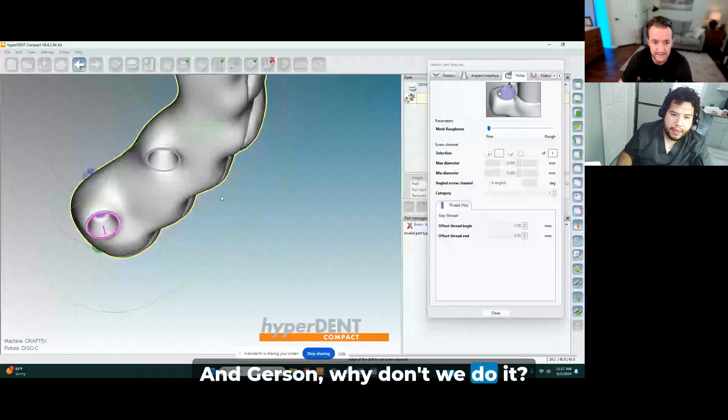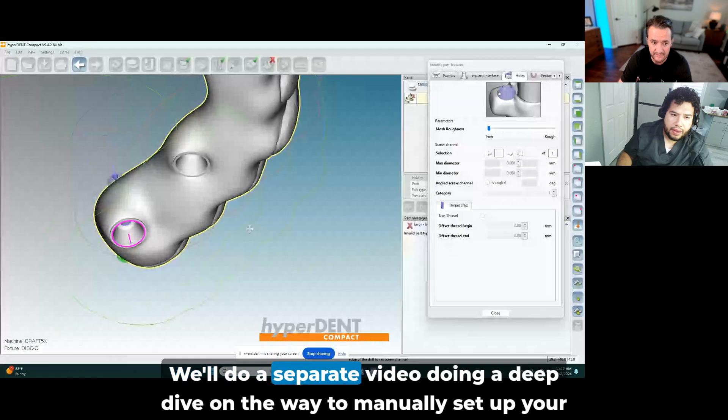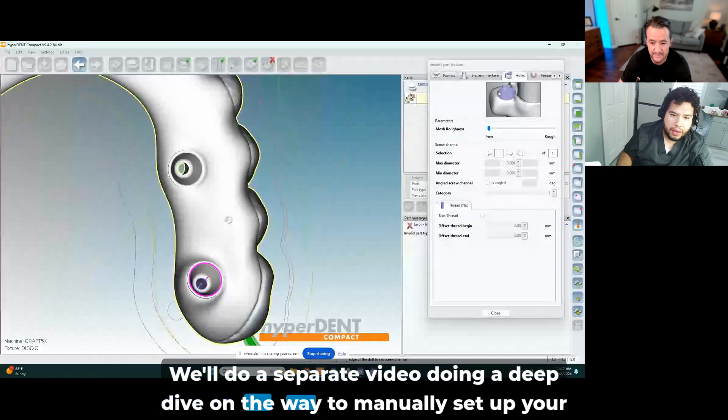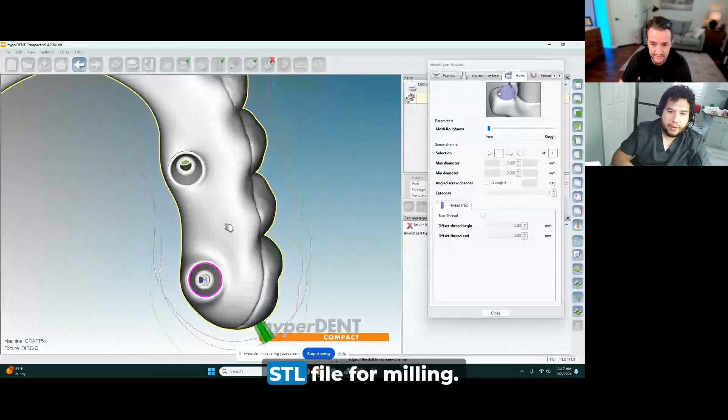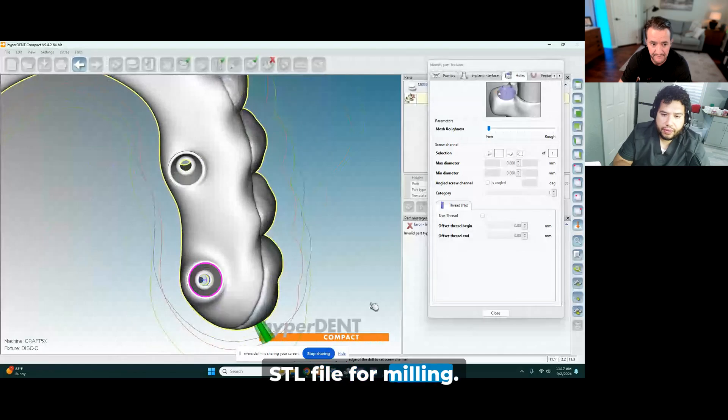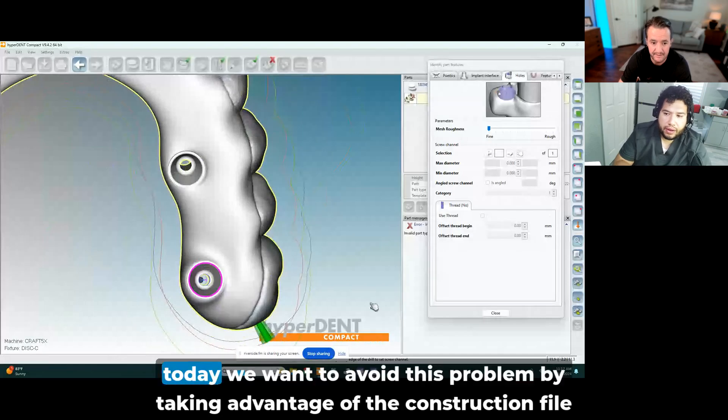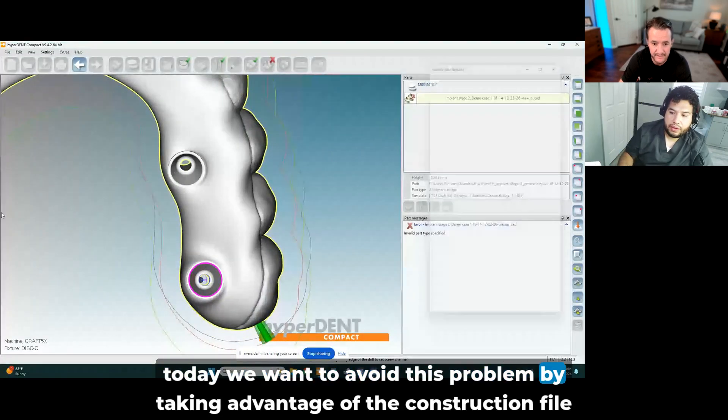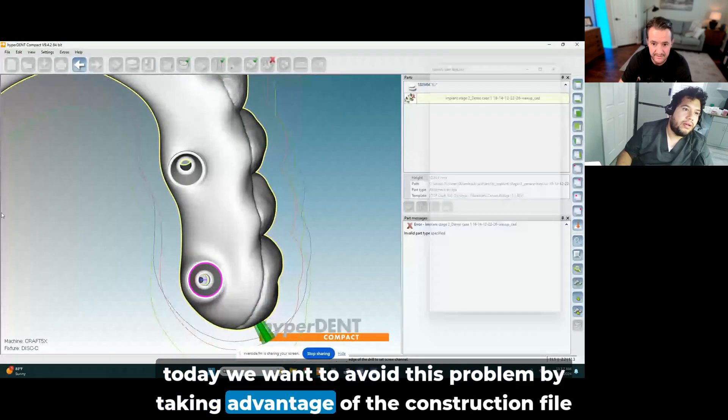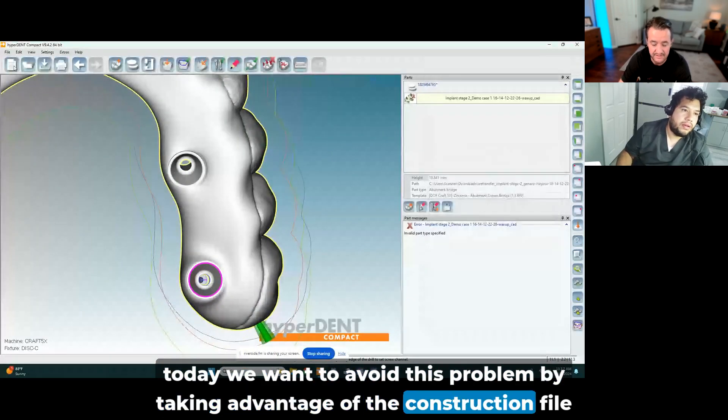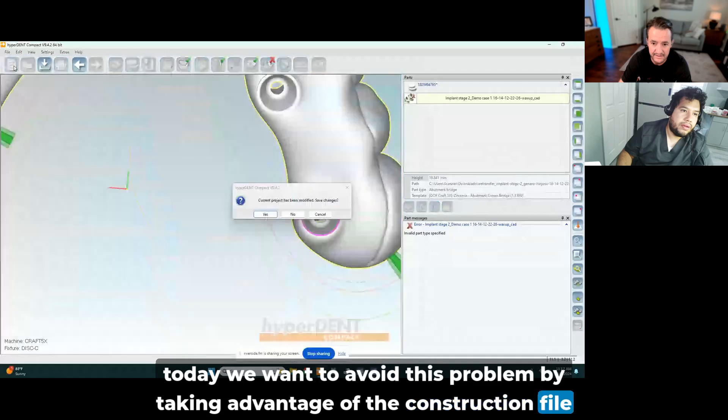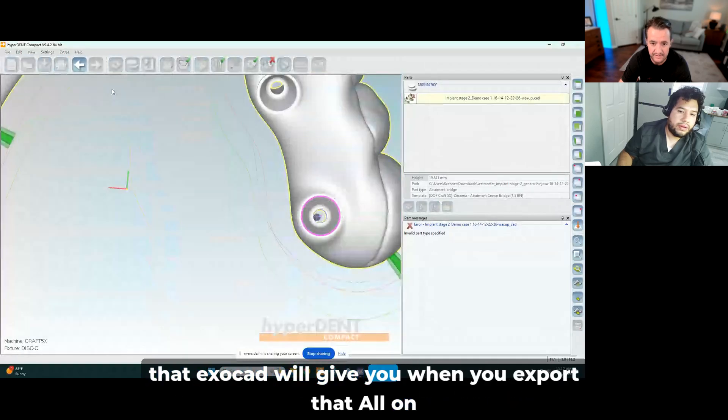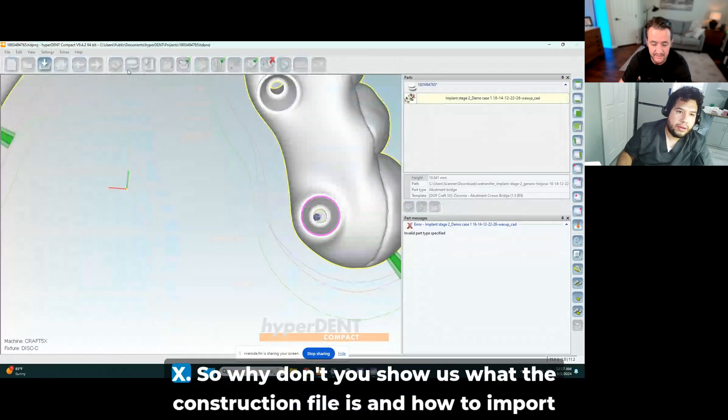So we know there's a way to do this manually, drawing the margin line and identifying the screw channel. We'll do a separate video doing a deep dive on the way to manually set up your STL file for milling. But today we want to avoid this problem.